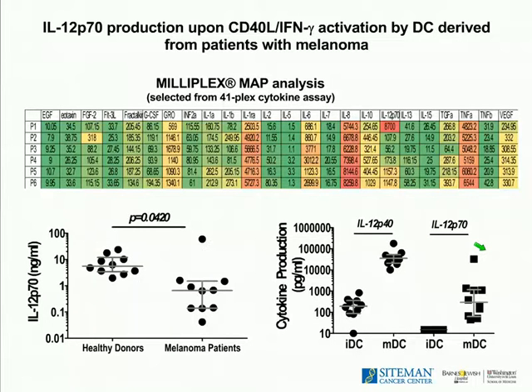and looked at the supernatants that were made from the dendritic cells once they were activated. I'm showing you here 24 out of the 41 cytokines that we tested, and we asked whether production of other cytokines was also affected in the non-clinical responders. And what you see here is that, for example, if you look at IL-6 or IL-8 or TNF-alpha, production of the cytokines is seen in all the patients.